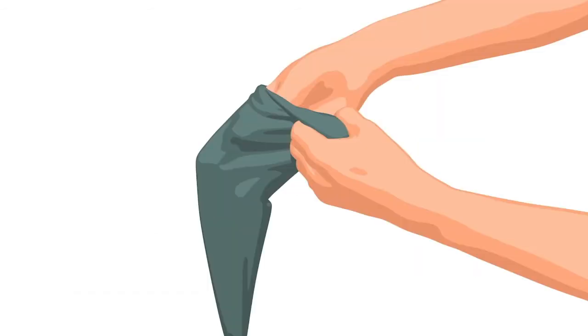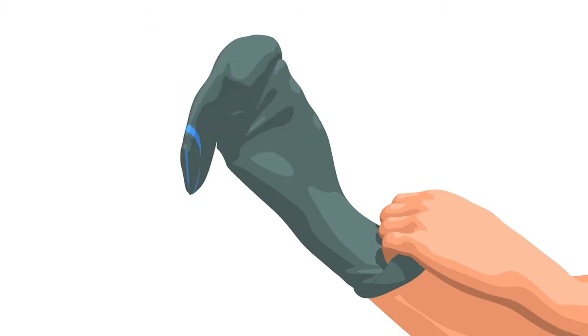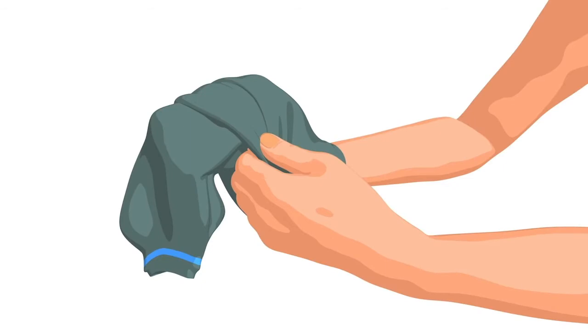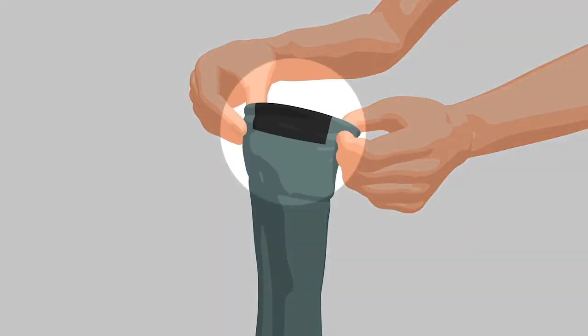The recommended way to apply a FITLEGS Anti-Embolism Stocking is by turning the stocking partially inside out. Put your hand inside the stocking from the knee and grasp the heel pocket as though you're holding a glove puppet. Then turn the stocking inside out, holding onto the heel with your finger and thumb. Look where the heel pocket is, it's clearly marked in black.